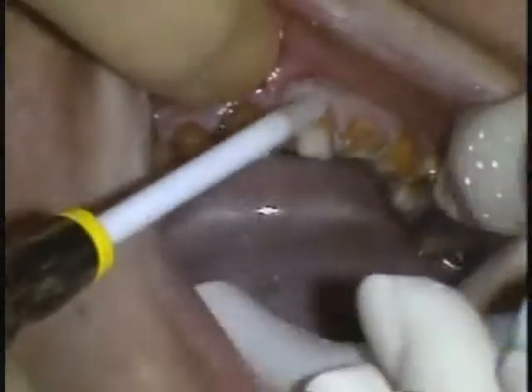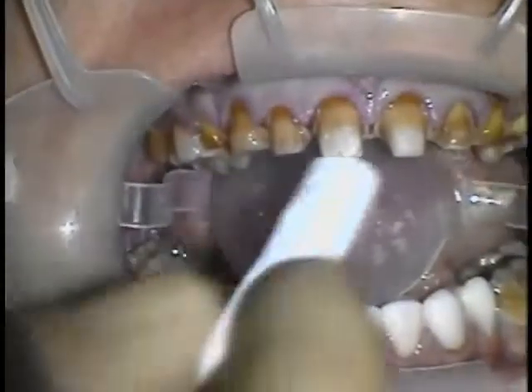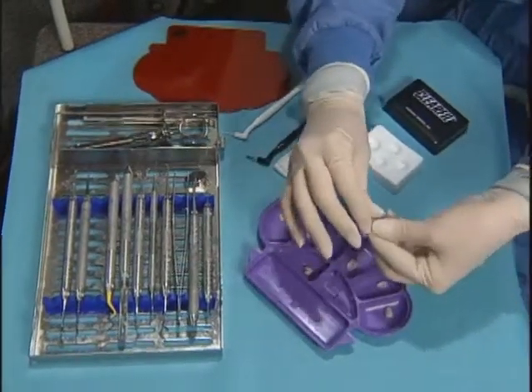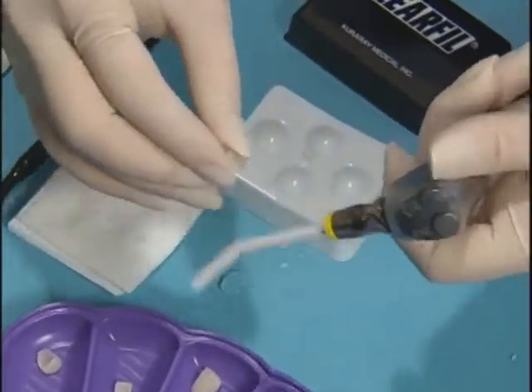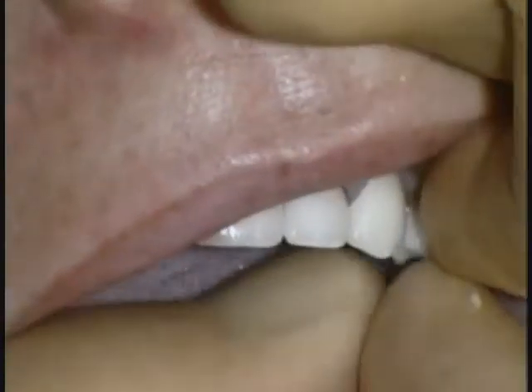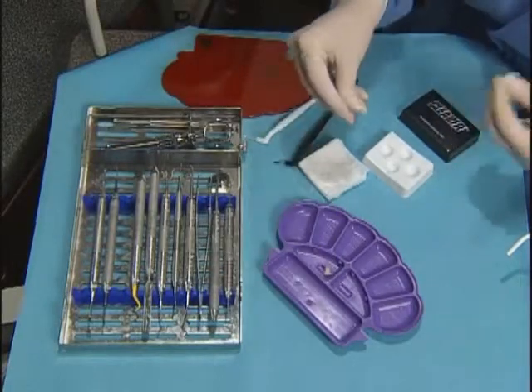After removing the temps and carefully cleaning the preparation, the veneers are tried in using the selected Clear Fill Aesthetic try-in paste. While I isolate the teeth with lip and cheek retractors and cotton rolls, the assistant prepares the veneers for try-in in the proper order. I prefer to use plain water for my veneer try-in. However, for those who would rather use it, the Clear Fill cement kit try-in paste will give a perfect match with the selected final cement shade. We always try to seat the veneers from upper right to upper left in sequence, checking for fit and color. After the assistant wets the etched surface of the veneer, she hands them to me in order for placement. When satisfied with the fit and shade, the veneers are removed in reverse order and the assistant places them in the light-shielded tray in the correct sequence for delivery.